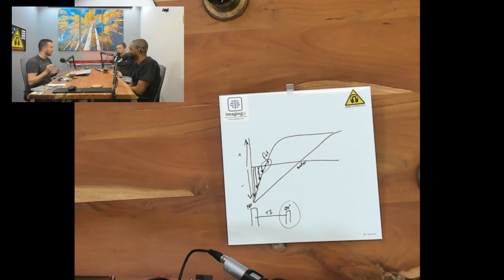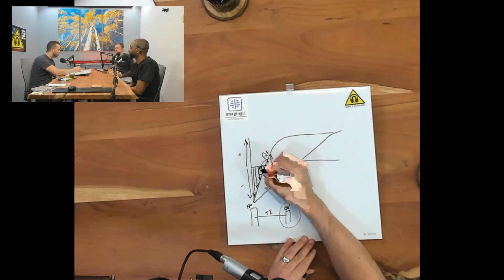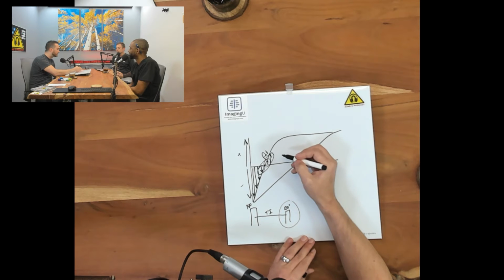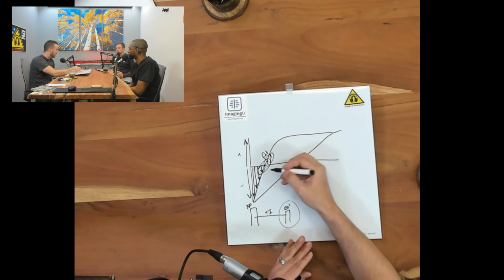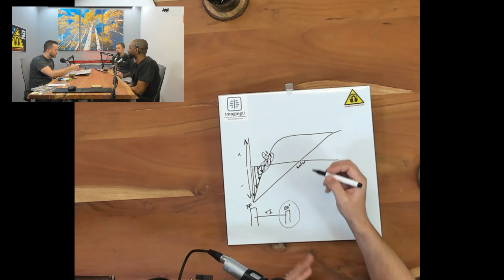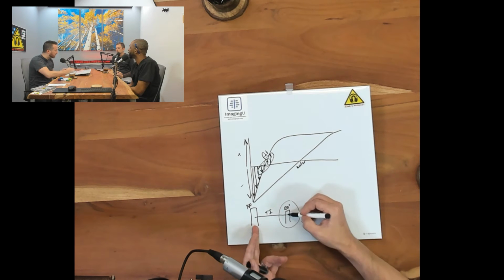There are no protons that get affected by the 90-degree pulse. You know what I mean? Yeah, yeah. I got it so wrong. And the thing about it is, if you're a little bit early or a little bit late, as long as you're doing magnitude reconstruction, then they will have the same signal intensity. And in this case, the difference is just our time, our inversion time.